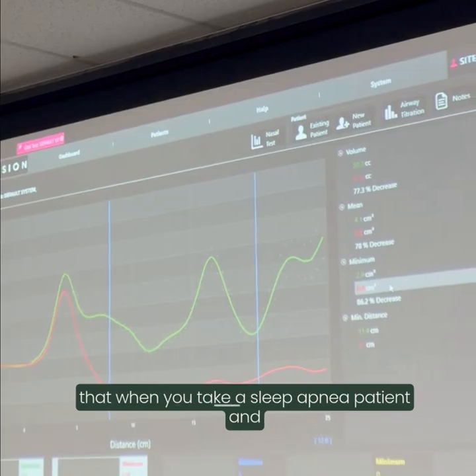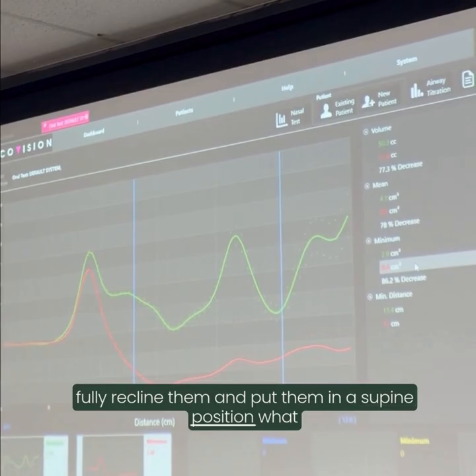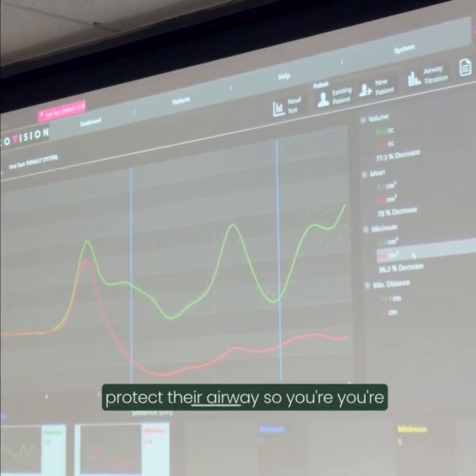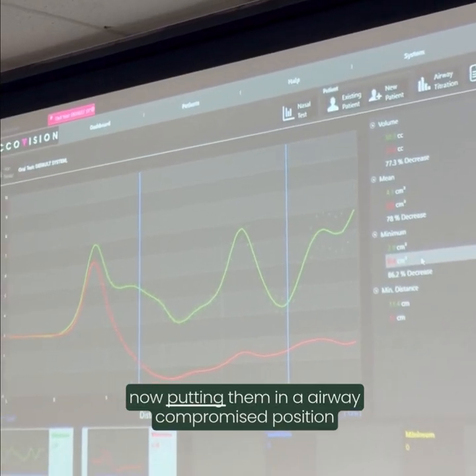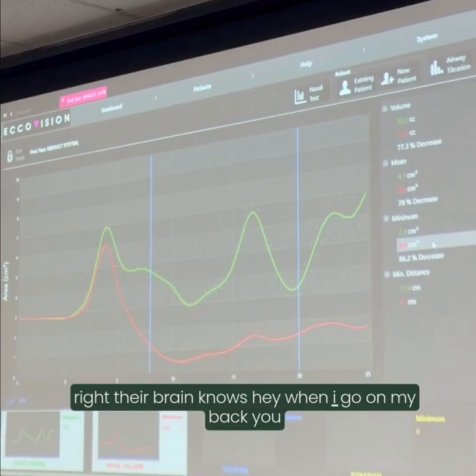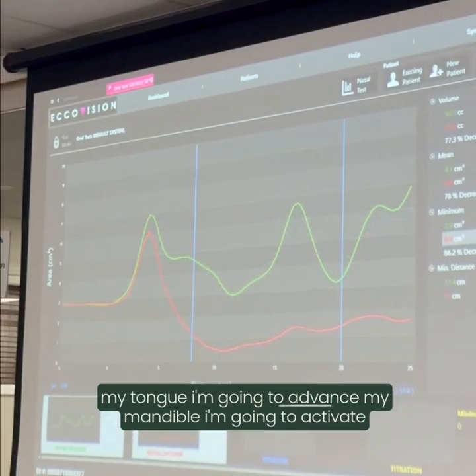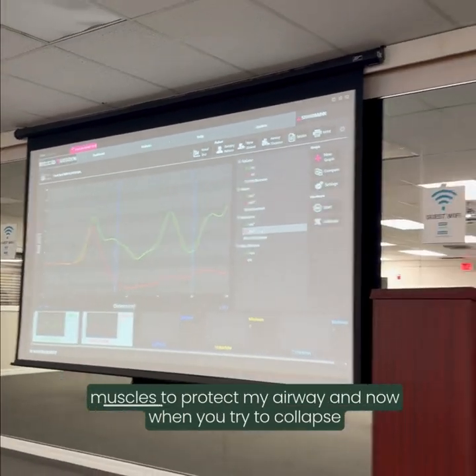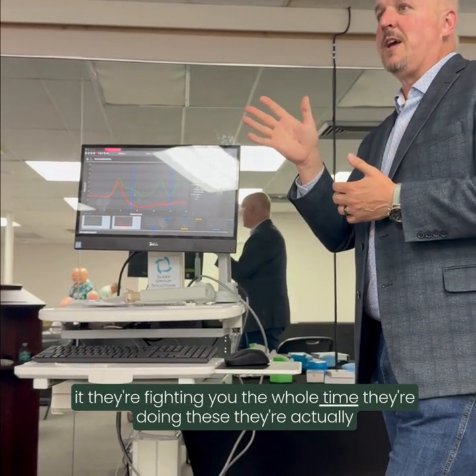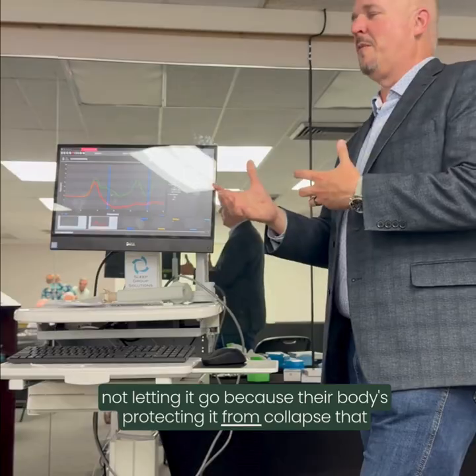is that when you take a sleep apnea patient and fully recline them and put them in a supine position, what you're going to see is they will unconsciously protect their airway. So you're now putting them in an airway compromised position, right? Their brain knows, hey, when I go on my back, you choke. So I'm going to thrust my tongue, I'm going to advance my mandible, I'm going to activate muscles to protect my airway. And now when you try to collapse it, they're fighting you the whole time. They're actually not letting it go because their body's protecting it from collapse.